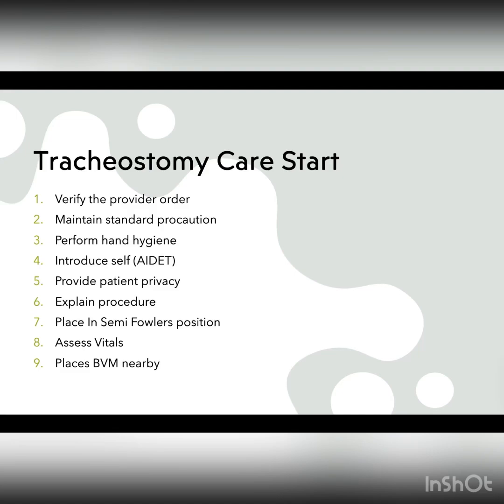Next, we have tracheostomy care. First and foremost, we want to verify the provider ordering care plan. We want to maintain standard precaution, which is the universal precaution provided to every single patient. We want to perform hand hygiene when it is indicated.